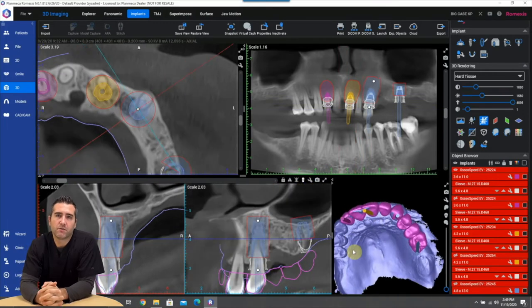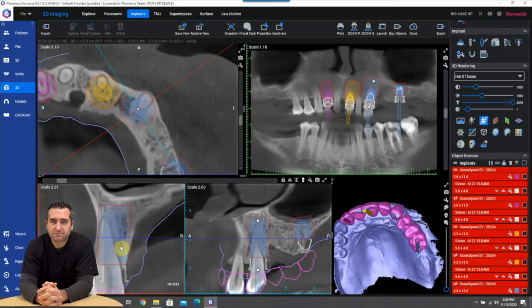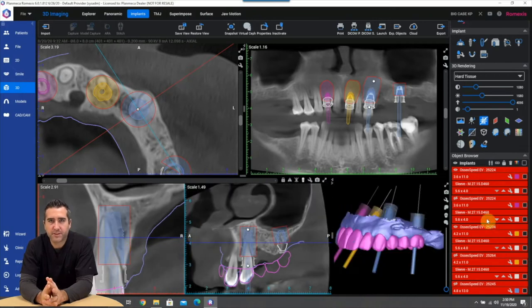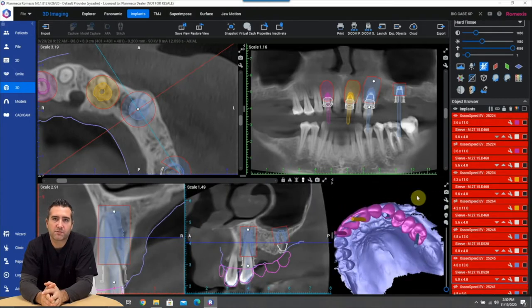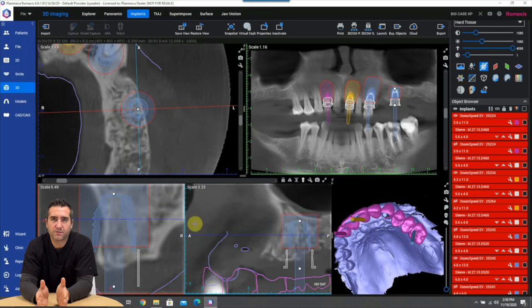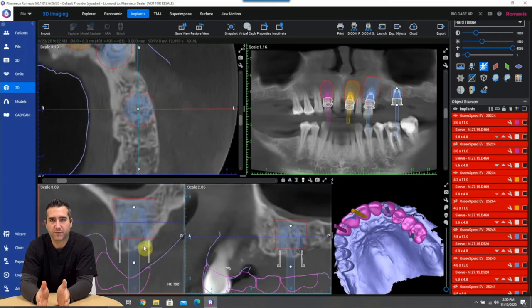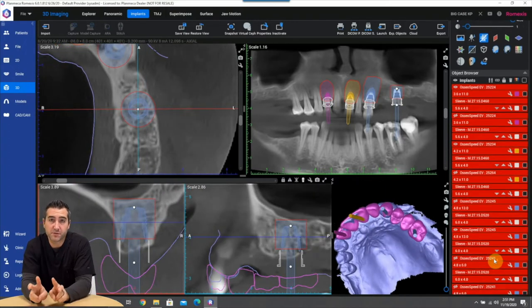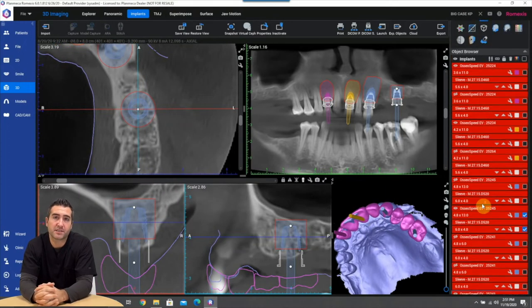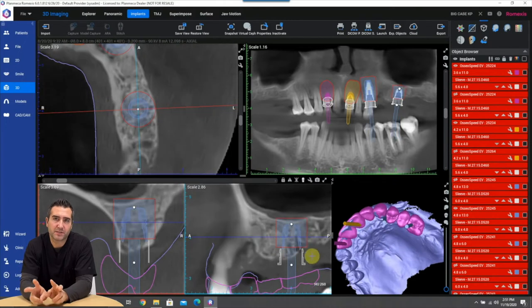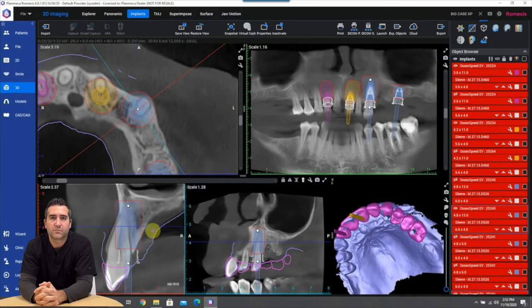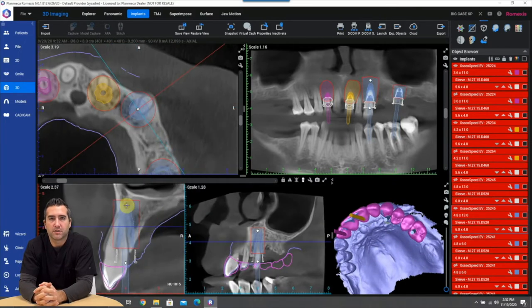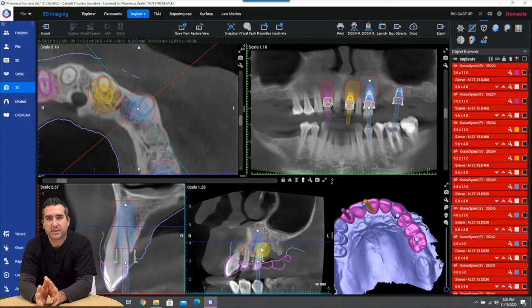Okay so once you have your implants placed virtually you're going to want to parallel some. So we're going to parallel the two anteriors and then we're going to parallel the posteriors to do separate and distinct final prostheses. This will be separate distinct bridges there and so Romexis makes it really easy to plan these.